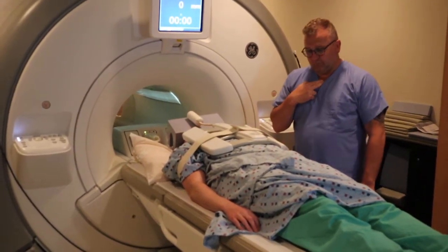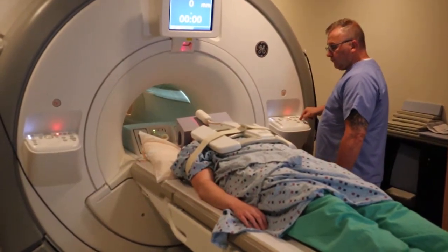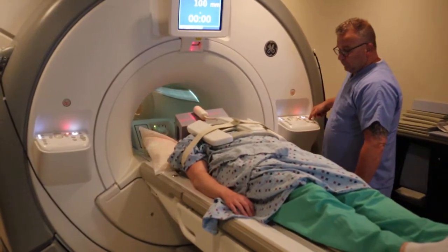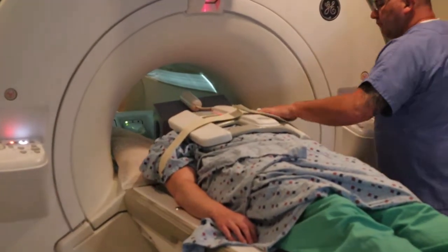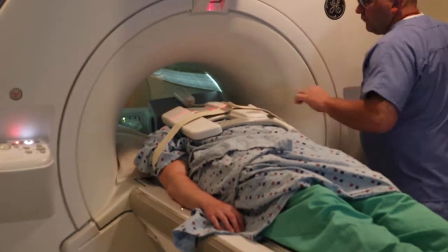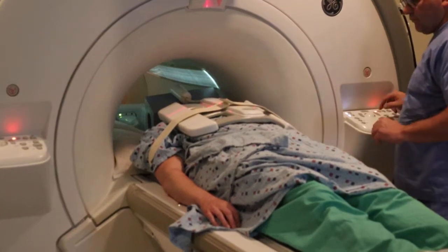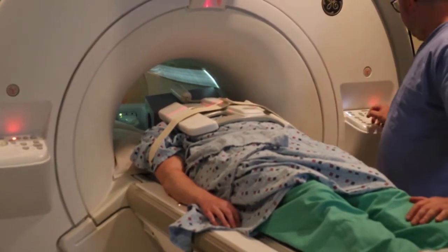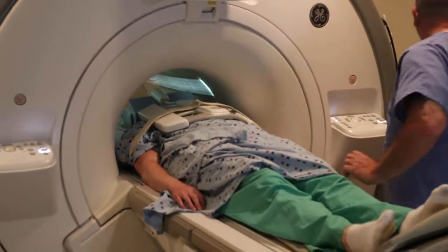You're going to position again two fingers above the sternal notch. Align the alignment light. Make sure that they're either centered or right or left side, landmark, and advance to scan.